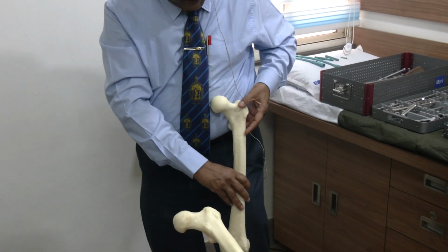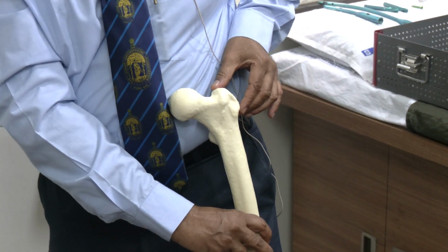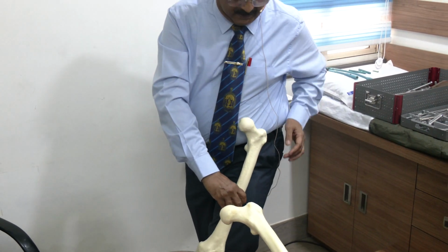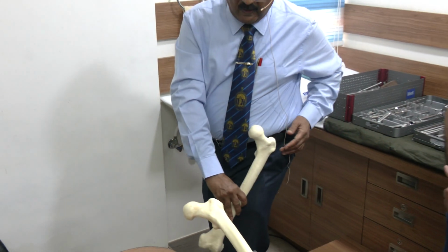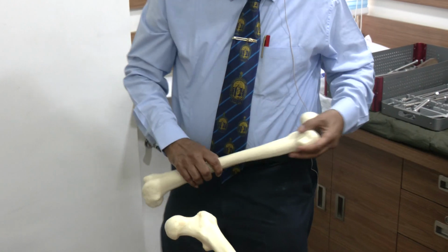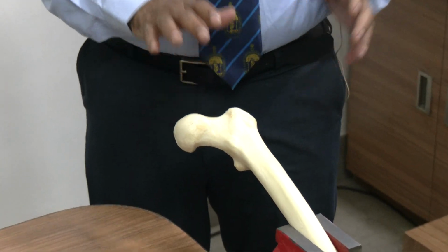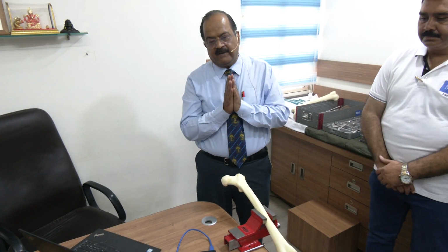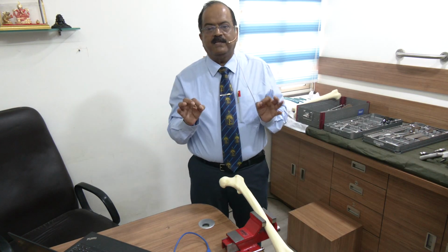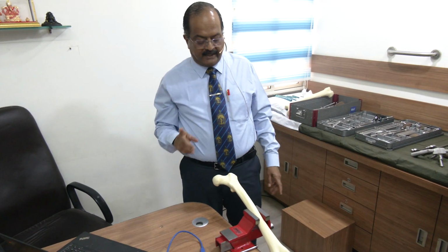I am showing my left side now. If the limb is abducted, passing a nail is not possible easily. But if the limb is adducted, in this fashion, then you can pass the nail from the side easily into the femur bone. So that is one advantage of fixing the fracture. And once you have reduced and fixed the fracture, your fracture will never go into varus or get displaced. So it's always better to fix the fracture with 2 K-wires, which I'll be showing again in the video.